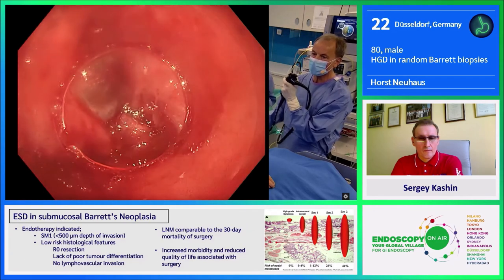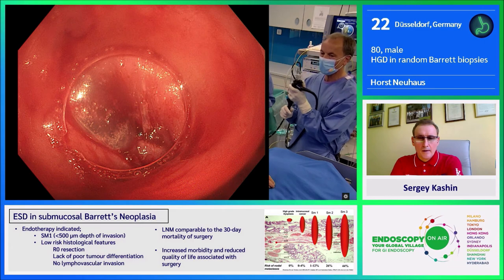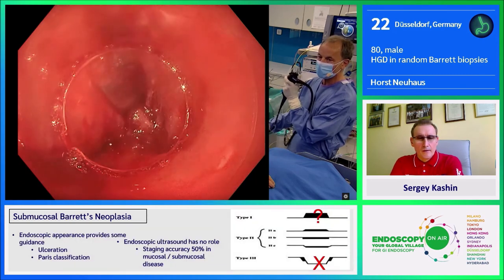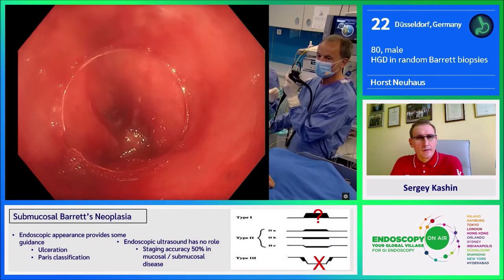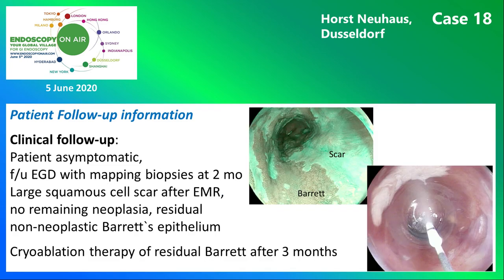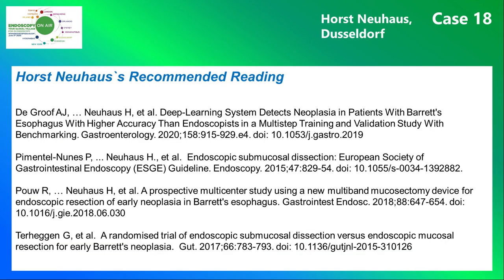You can see there is no bridge between the resected areas. The resection area is very large — this would have taken more time with ESD. Histology showed a low-risk adenocarcinoma resected R0 basally. Follow-up showed remaining normal Barrett's esophagus beside a scar, which was treated with cryoablation. Here you see the instruments and devices used. And finally, this is Horst Neuhaus's recommended reading.